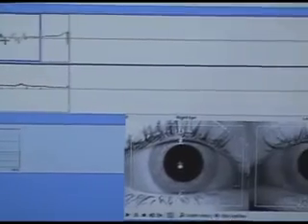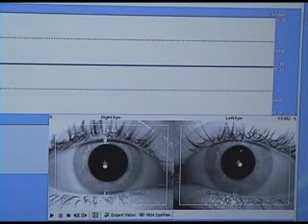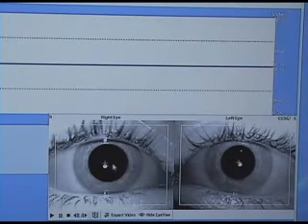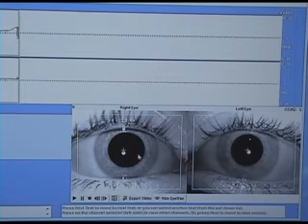It's interesting because you can compare other findings. Typically, when the brain is not firing so well on one side or one hemisphere, you'll usually get a larger pupil on that side. Not always, but usually. And you can see that this right pupil, this patient is actually facing us, this right pupil is larger. So we can correlate the optokinetic findings with all the other findings that we see in our neurological exam and in our advanced neurological testing. We'll see a larger pupil on the side of deficient brain.